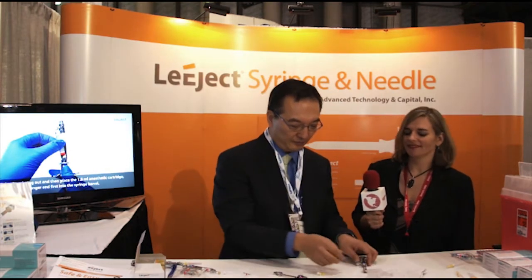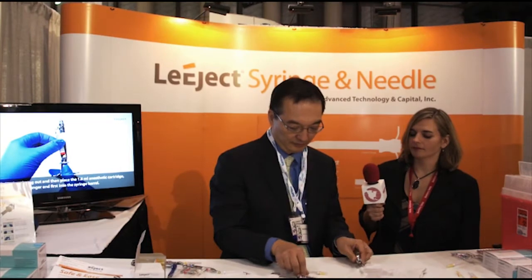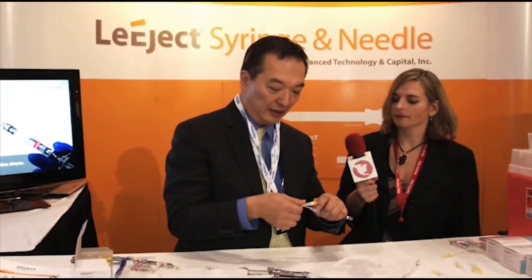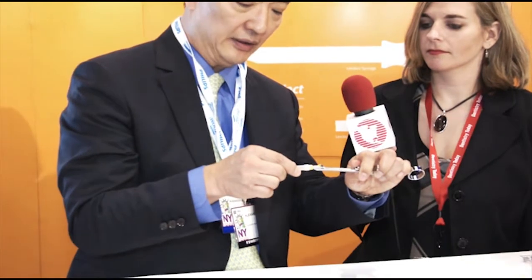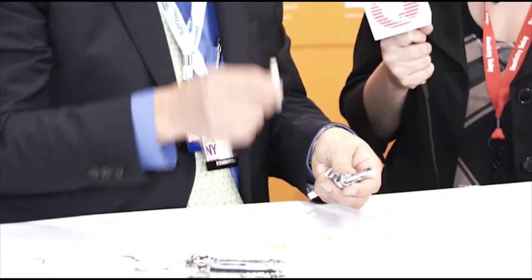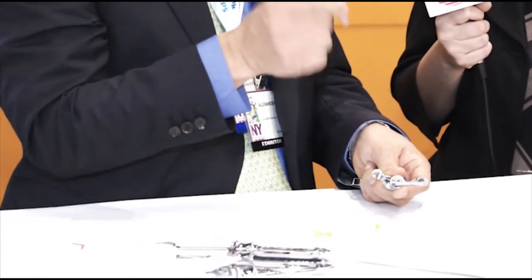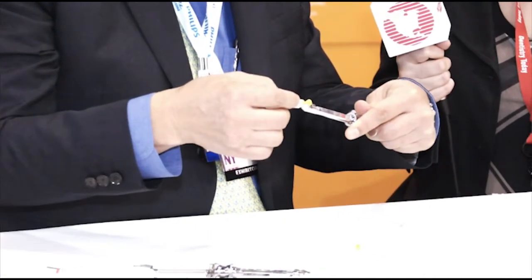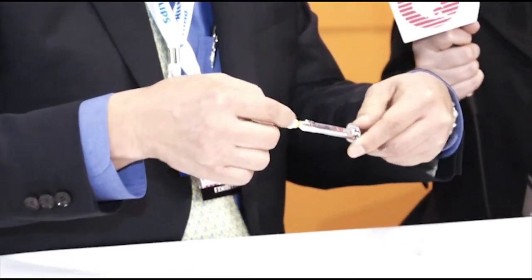Sure, my pleasure. So, this is a new syringe, and this is a new needle. The needle comes into the syringe sideways and slides forward. Let me demonstrate that for you. Any dental anesthetic cartridge goes in, and the needle goes in and slides forward.